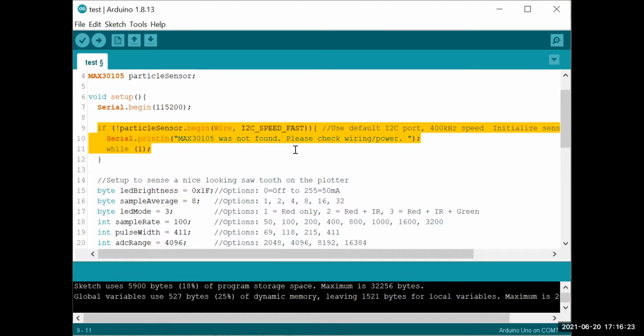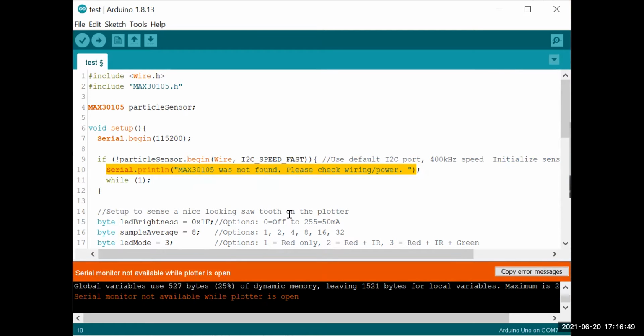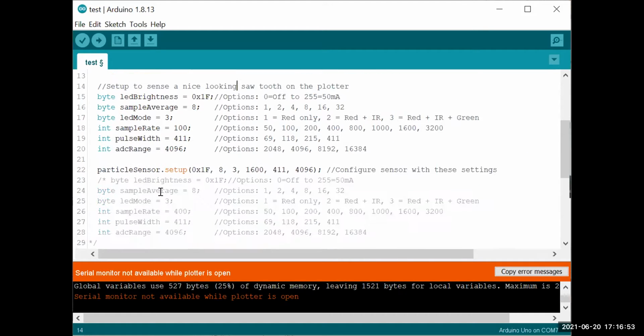Then this part is specifically for the serial monitor. It's essentially just getting the particle sensor, loading the library. Then if it turns out to be collecting data too fast, that's essentially the sensor knowing that your finger's not there. So it will tell you through the serial print that your finger's not there, there's a problem. So that's just something for you to know going in.